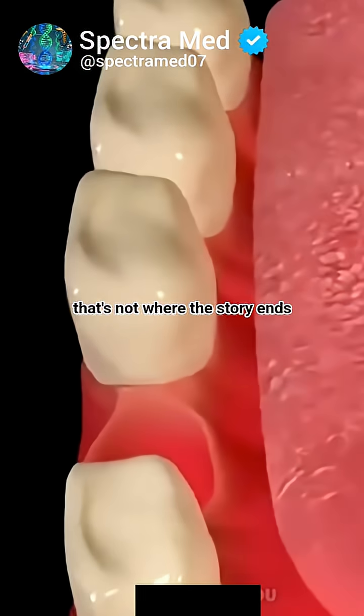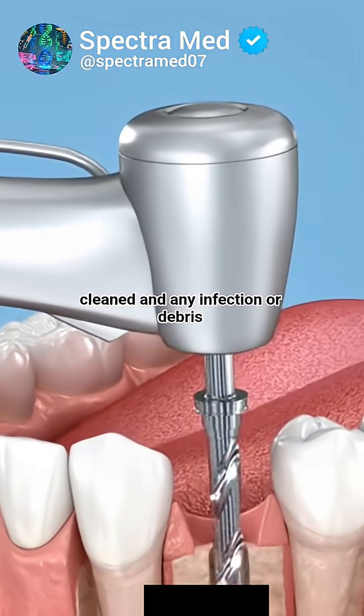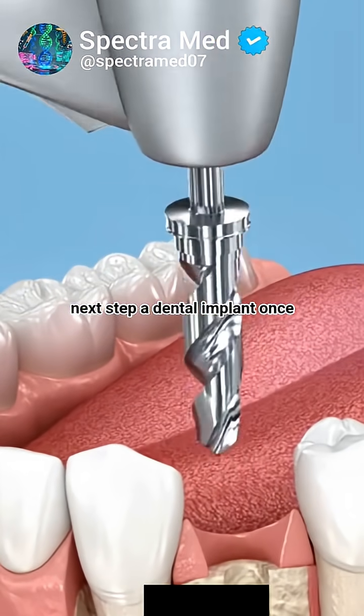But that's not where the story ends. After the extraction, the socket is cleaned, and any infection or debris is removed to prepare for the next step: a dental implant.